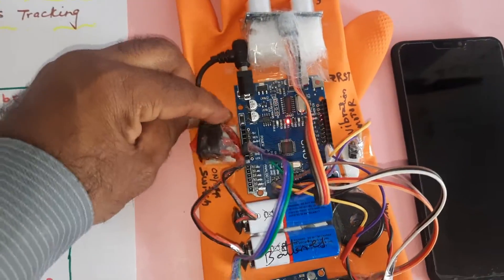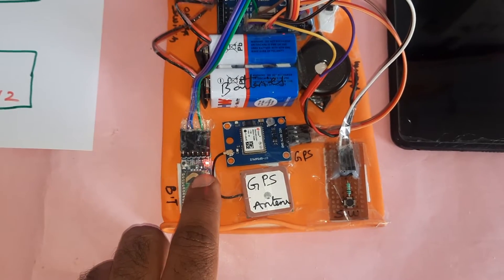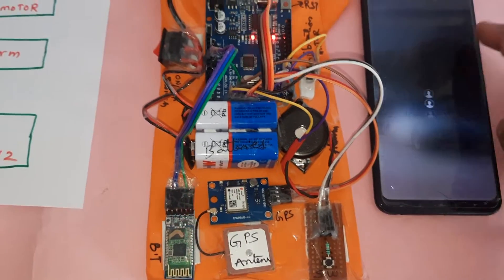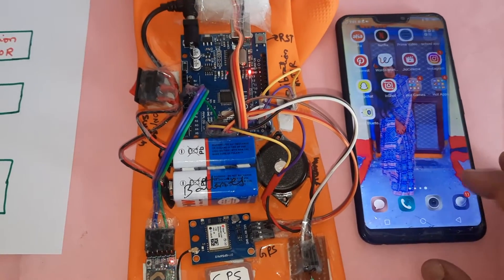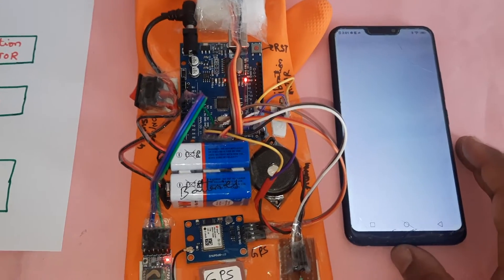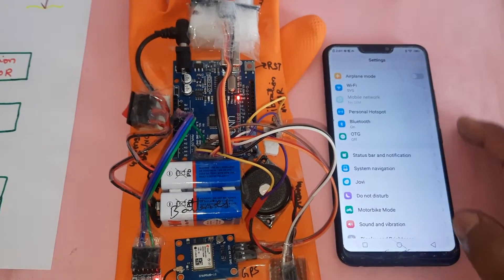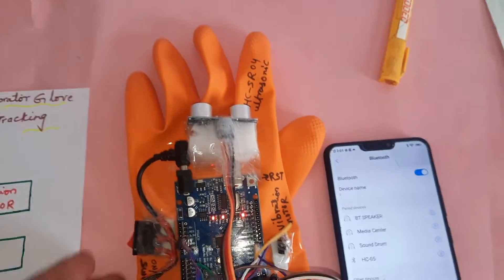Now I am going to give the power supply - power supply is on, Bluetooth is also on. First you have to go to Settings, then go to Bluetooth. Here Bluetooth HC-05 is connected.